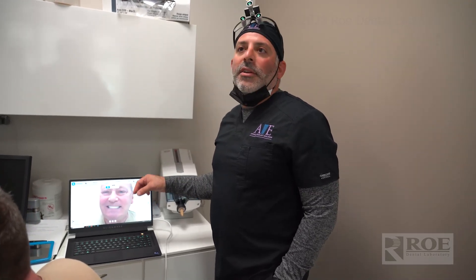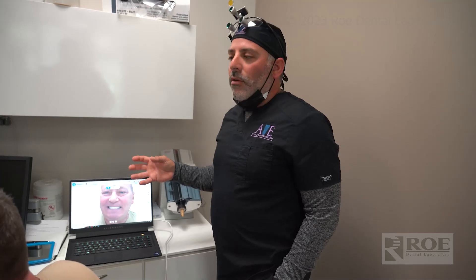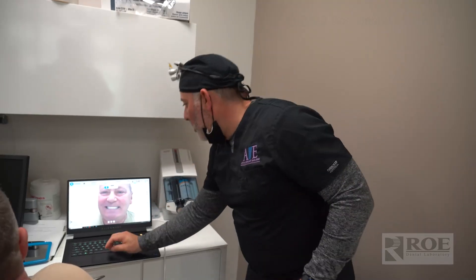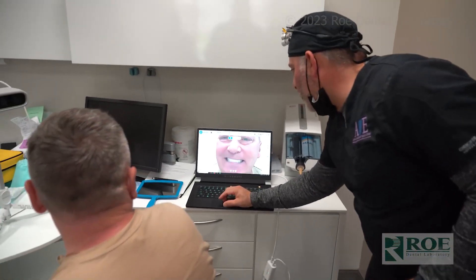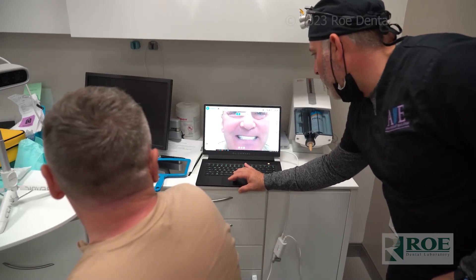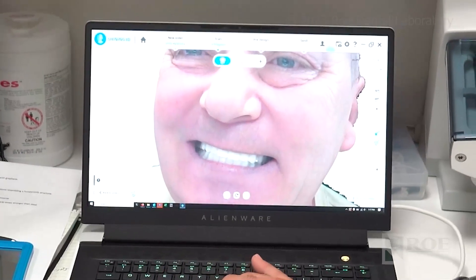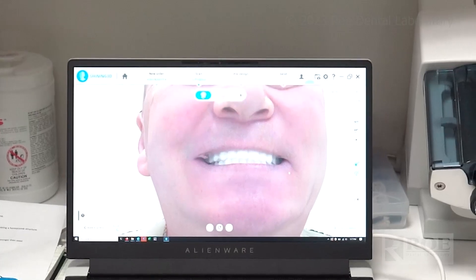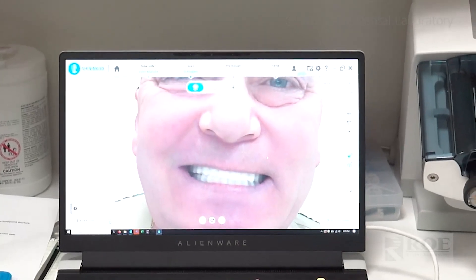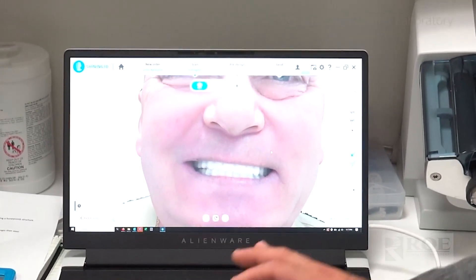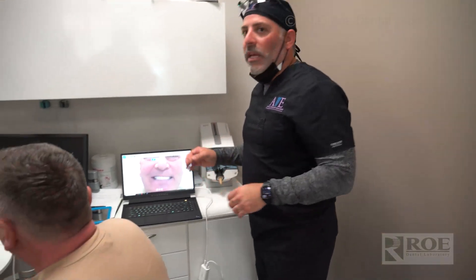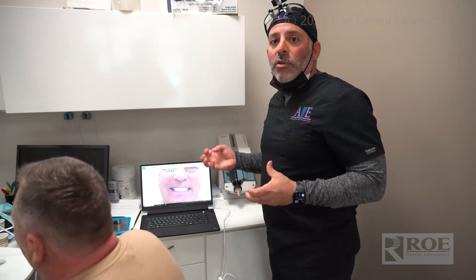But what's beautiful about it is, let's say it doesn't auto-match. With a lot of facial scanners in the past, the teeth were blurred out, so you couldn't really find the exact spots to match on the actual teeth. Here, this is quite easy. If I need three-point matching, I can pick the canine with ease, I can pick the centrals with ease, another canine, even go back to the premolars and match it here. So it really makes it a piece of cake when the auto-match feature doesn't work and we want to do it manually, because we can actually capture the teeth.